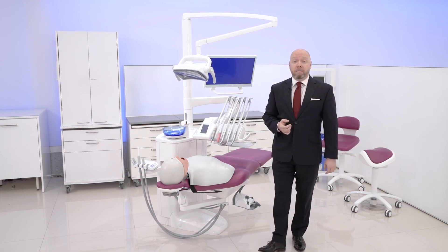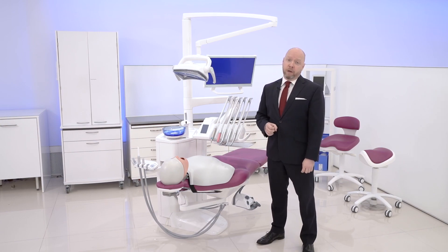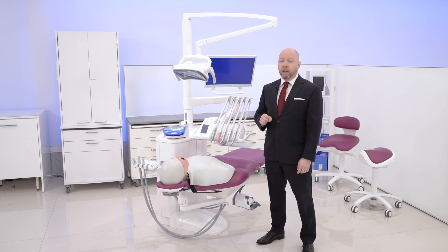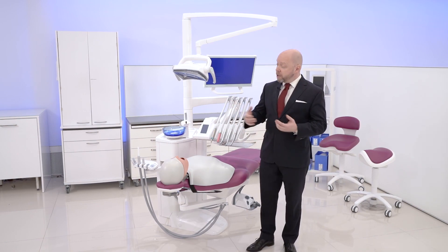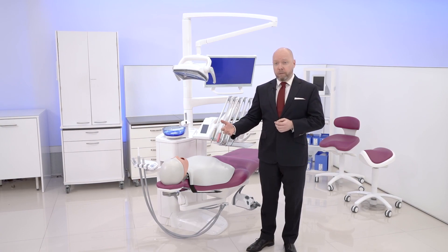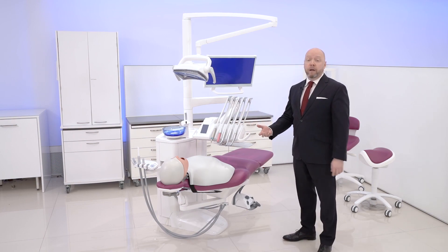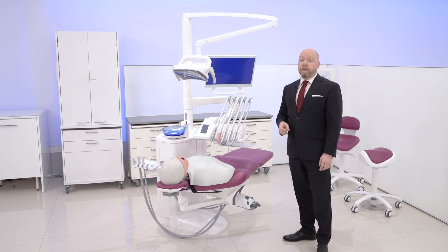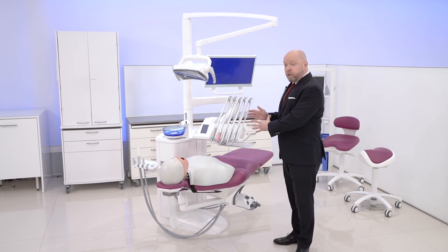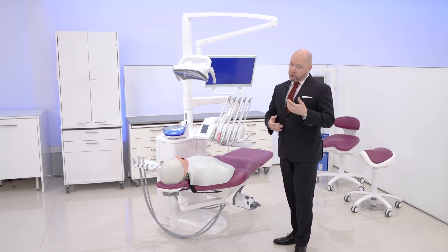You might know the Compact line from before — there are over 50,000 of them in use globally. This is the fifth generation of the product line, and with this generation we are pushing the usability and hygiene concepts further than ever before, while building on the tradition and experience from the previous product lines, like the side-lifting chair, the small footprint, and the IT integration that future-proofs your investment.